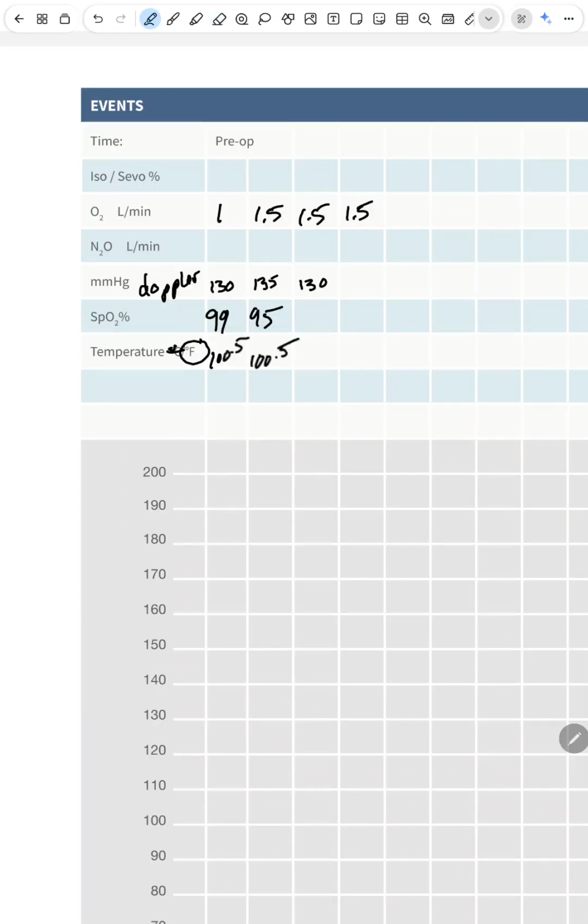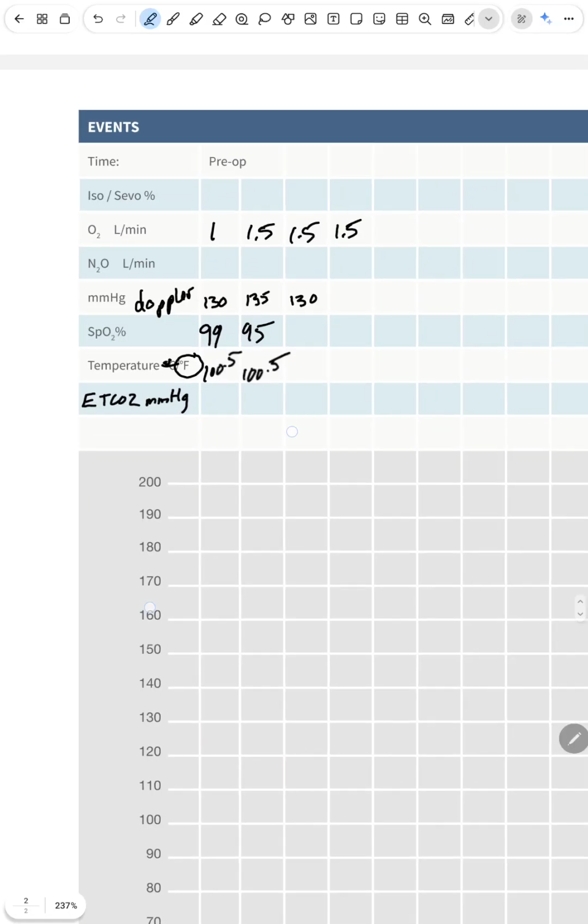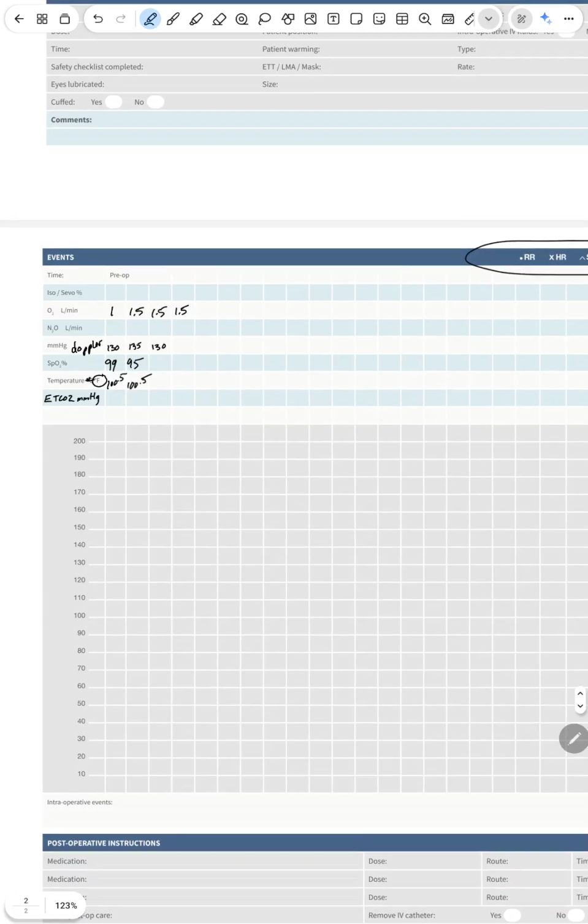And on that last sheet, it just said SpO2, EtCO2, and it did not have its unit next to it. So I'm going to be very specific, because this page would like us to be very specific. Love it. I'm going to follow that example. And then as the vital signs show up, I'm going to start writing them down, just like we always do.